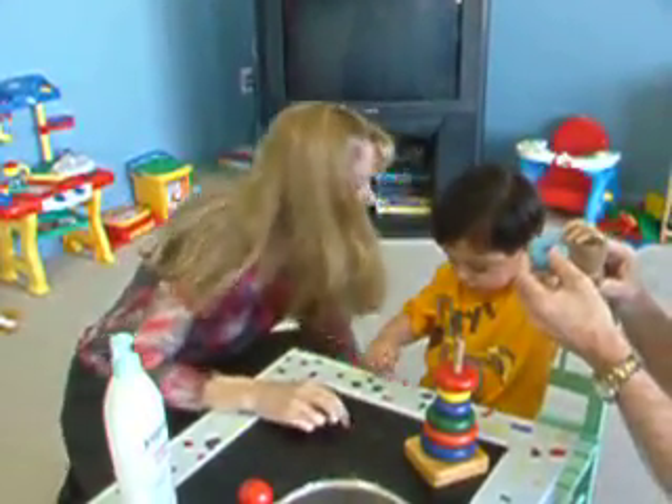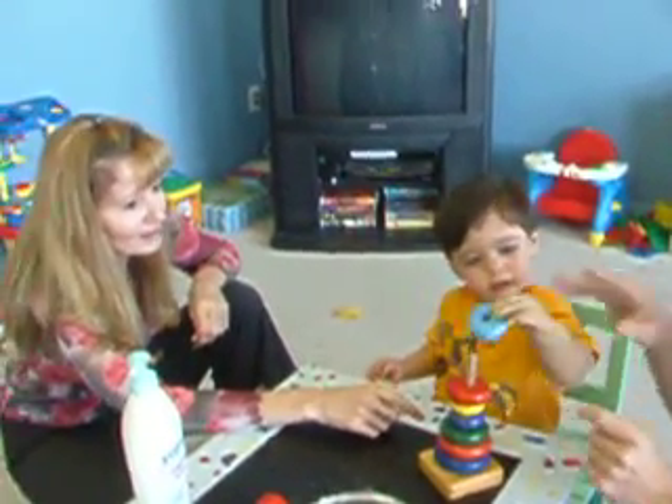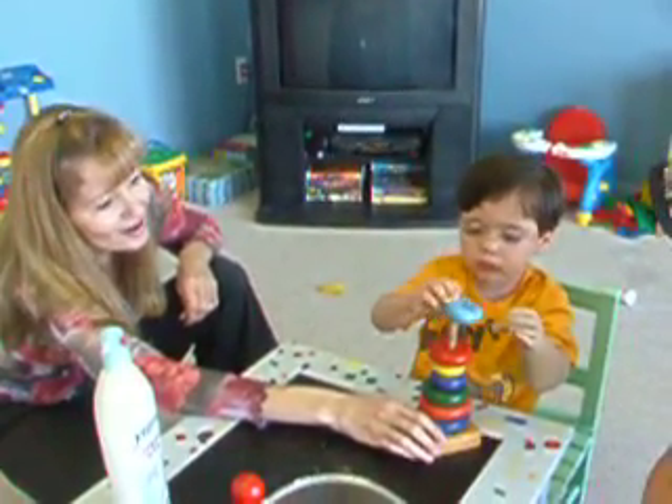Reach way up here. Look here. Christopher, open. Open. Shut. There you go. Now do it, baby. Two hands. Great. Using both hands, you're doing great. That's okay.